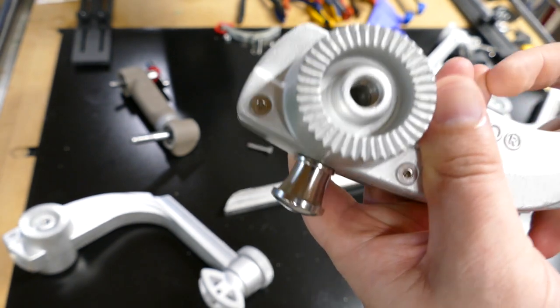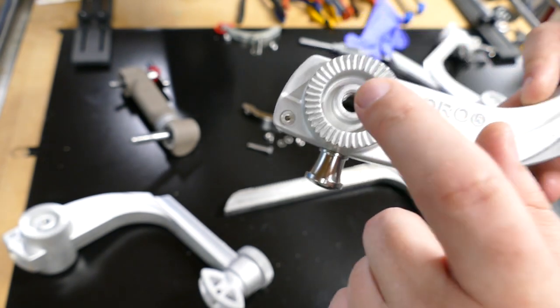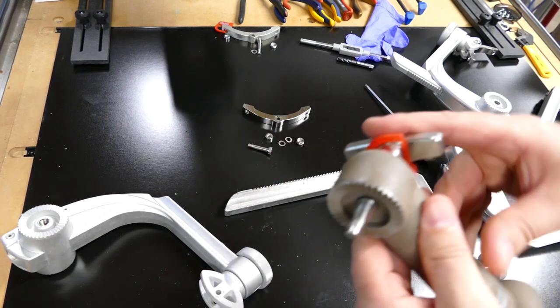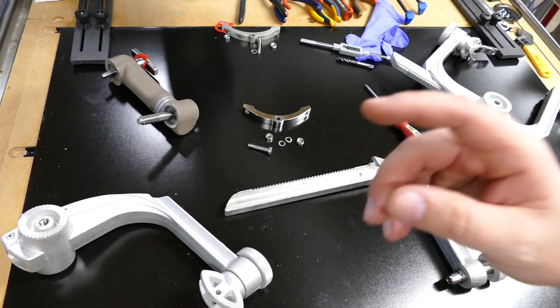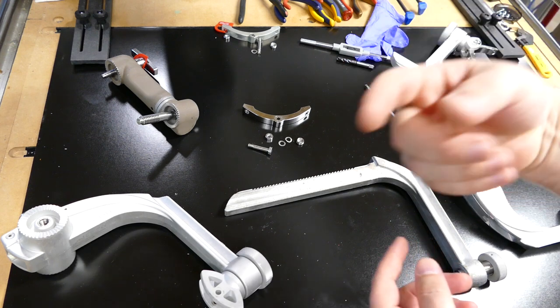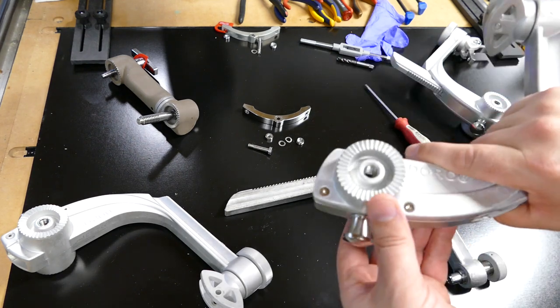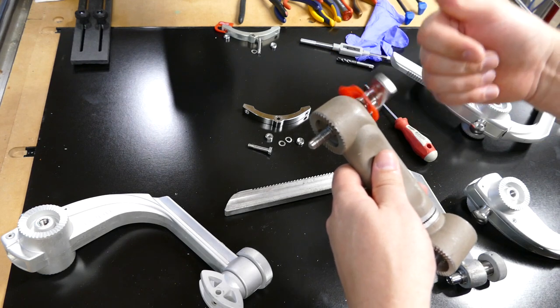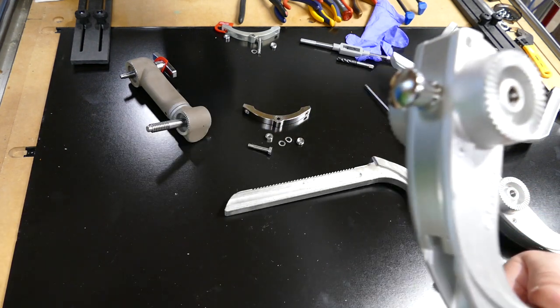Beautiful threads. But if you can pull out the helicoil, which you might be able to do with a fine flat blade screwdriver, you can reinsert the helicoil. And I believe that this one here is a 1/2 by 13 coarse thread. I can check that on this guy later. But you can correct those by inserting a new helicoil, which will come in a kit. It's a series of coils and a T-handle. And what you do is you screw the T-handle in with Loctite on the new helicoil, and then you unscrew the T-handle and the helicoil stays in the hole, just like this one. So this one's fixable. That one over there, it's a total loss because the users put this guy in and they just kept screwing it and screwing it until it eventually bound up total. Oh well, it's only money, right?